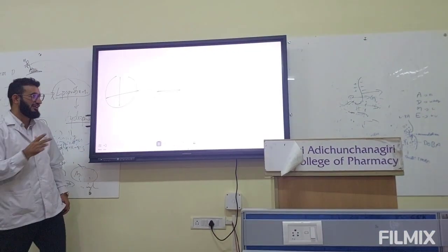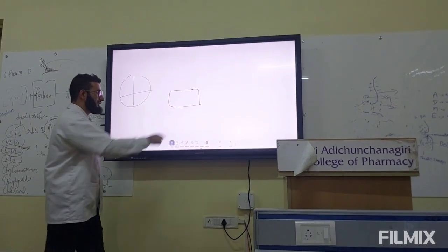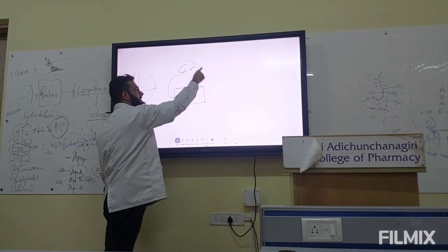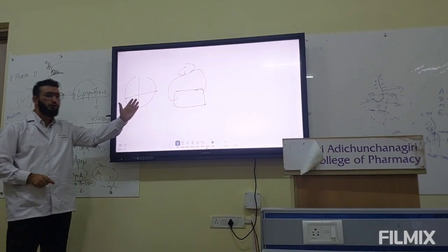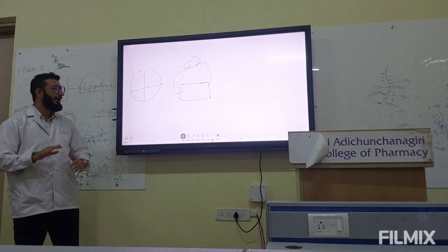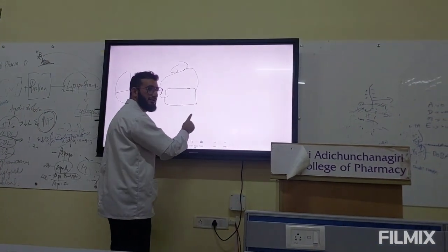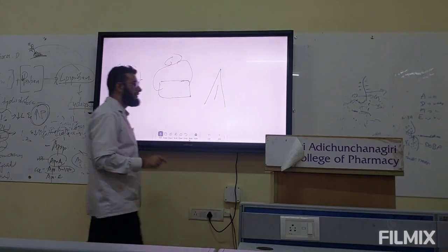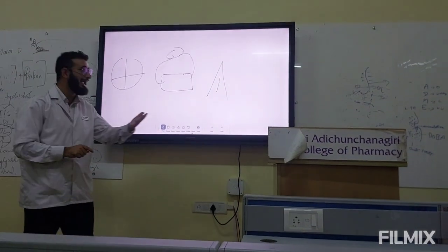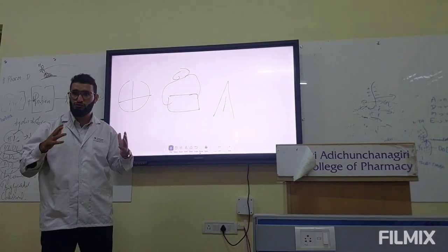It can detect an electrical signal. It's a device. Since the myocardial cell in the ventricle is fast conducting and produces strong current, the deflection will be rapid because it's a fast conductor, and the deflection will be greater in magnitude because it produces strong current.